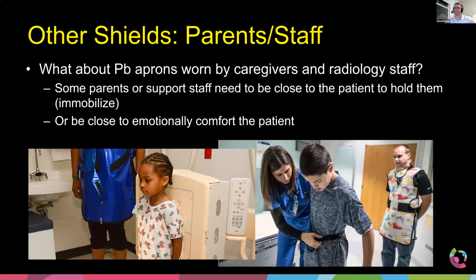Yeah, sure. So one thing: how do you think about the collimator blade effectiveness, especially for the high kV technique? And another question is about bone marrow shielding. Is there any bone marrow shielding? Great question. I'll answer the first one.